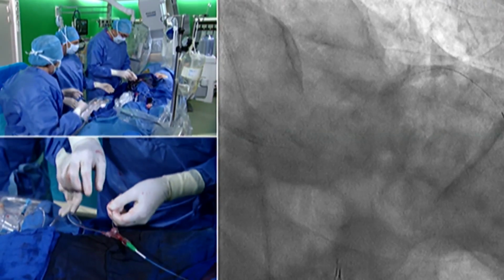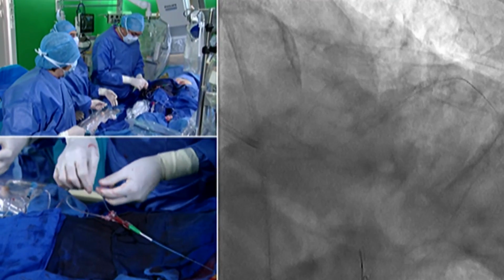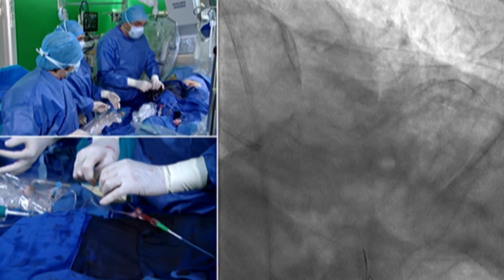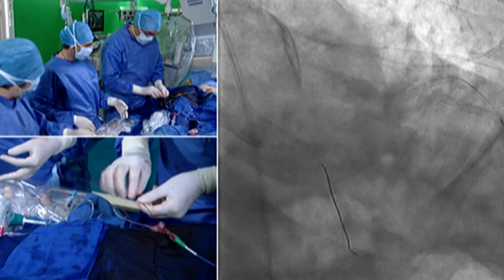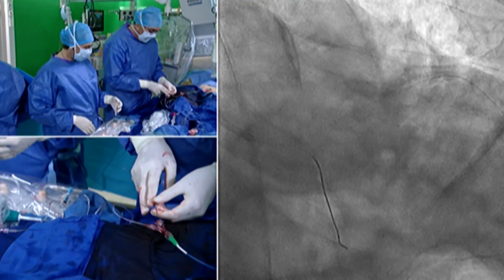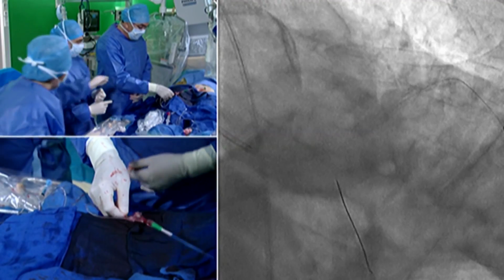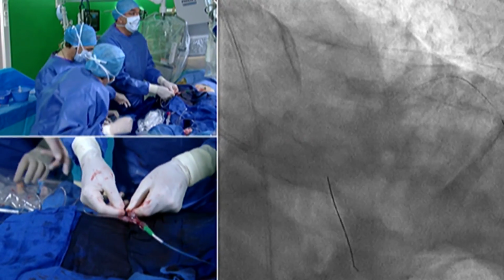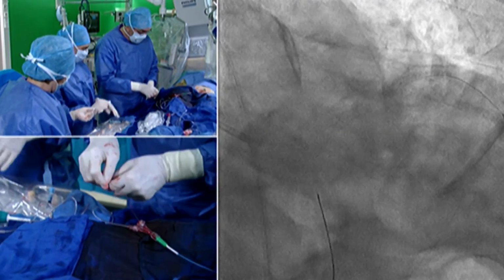It's true that we could anticipate at the beginning that the vessel would be a 4-0, but the use of this co-registration can show you exactly the point of the malapposition. And this is really fantastic to see that. And it's really easy to use.